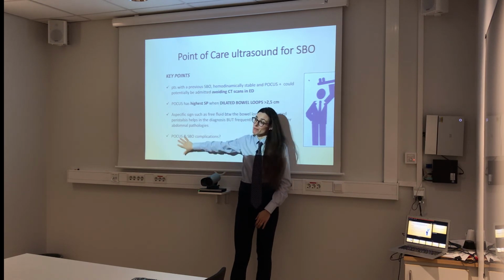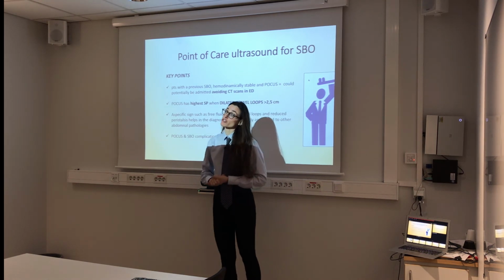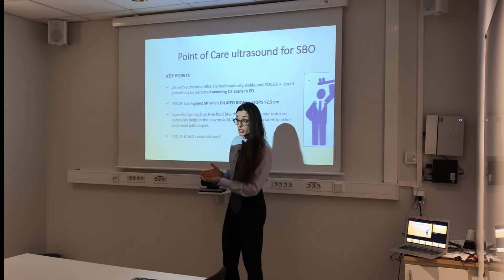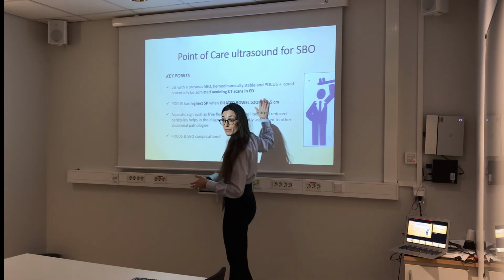So none of them, as you can see, is pathognomonic of point of care ultrasound diagnosis, but they can help you. Altogether, of course, they increase your suspicion and diagnosis, okay? None of them is pathognomonic. If you got free air in the portal vein with the ultrasound, this is necrotizing enterocolitis. This is pathognomonic, right? Here, there is nothing that is pathognomonic, but everything contributes to suggest the diagnosis. Plus, this is very specific, okay?